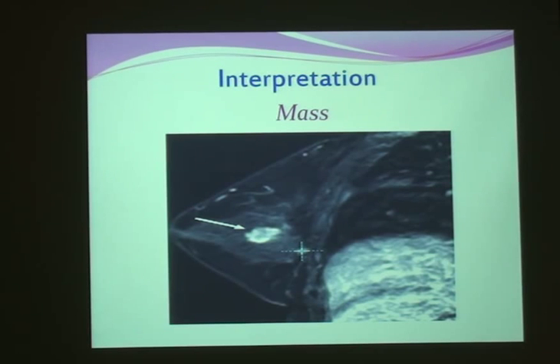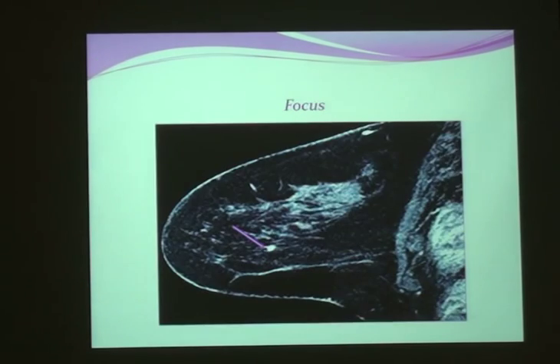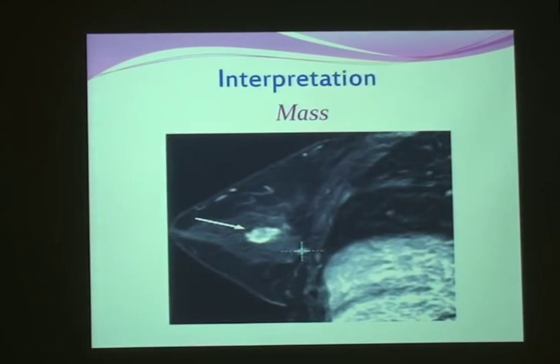For morphology, according to the ACR, we have 1 of 3 types of lesion. The first is a mass, which is a space-occupying lesion that can be appreciated in pre- and post-contrast images. If we have a mass, we should assess it in every way we know, like the margins, the appearance, and the pattern of enhancement, peripheral and central. This is very important.